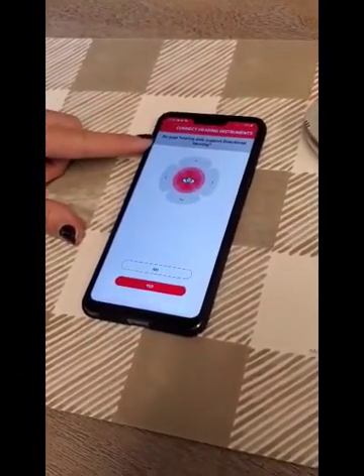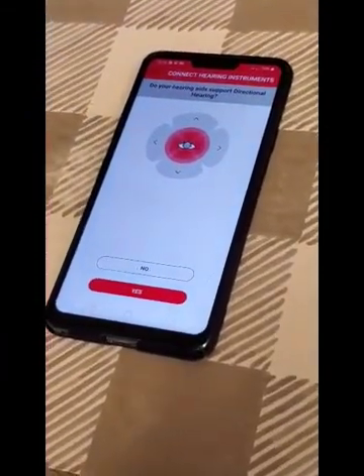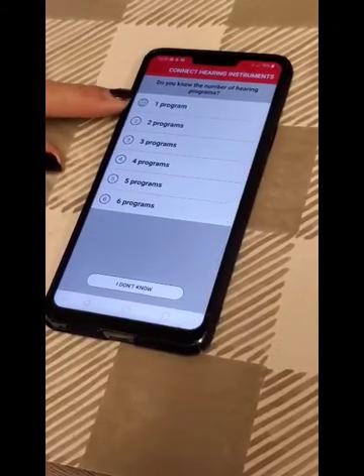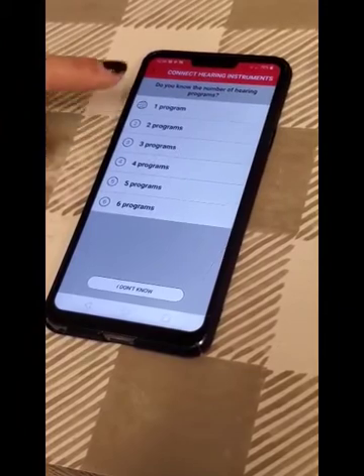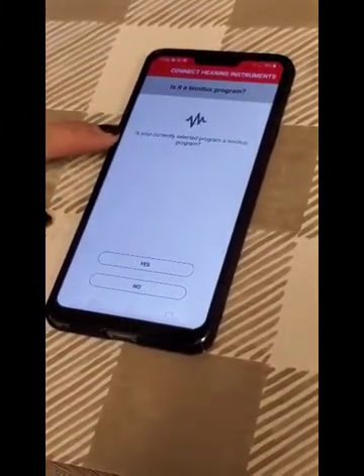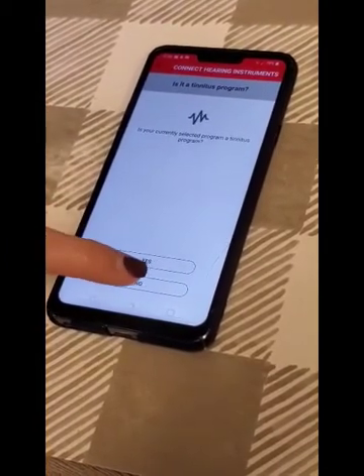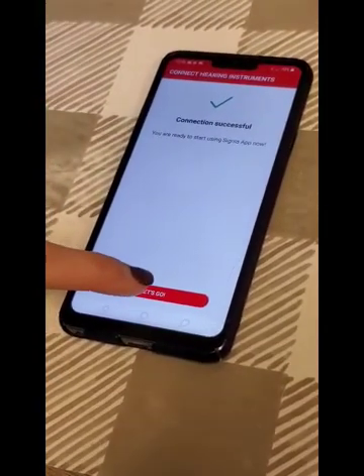Do your hearing aids support directional hearing? There are some that do and some that don't — you can always ask me if you have one that's compatible. Most of them do, so we're going to go ahead and hit Yes. Most hearing aids now have one automatic program, but sometimes we do add different programs. Most of my patients, we start with one program. If you have a tinnitus program, that's when you'll hit Yes here — you can ask me if we have a specific program for that. Most we just say No. The connection should be successful, and we'll go ahead and hit Let's Go.